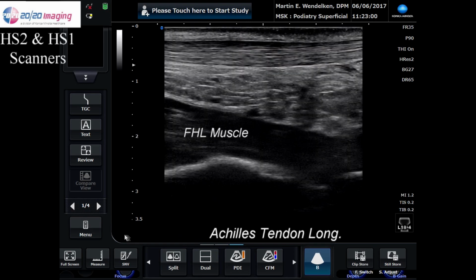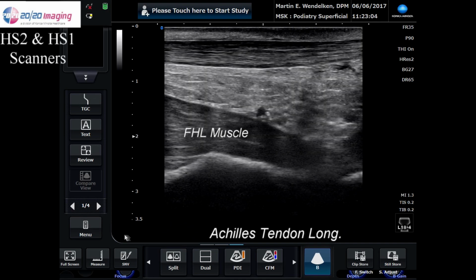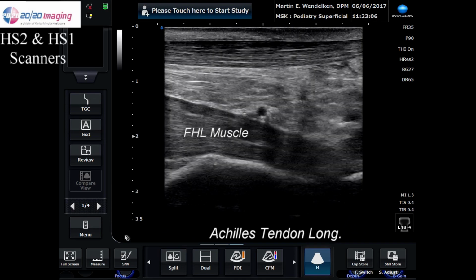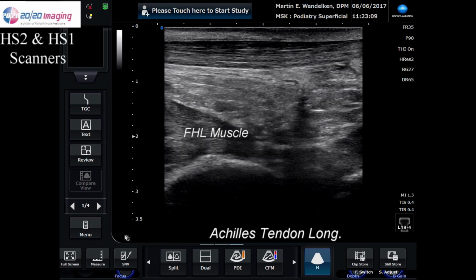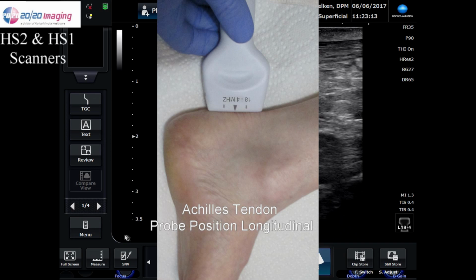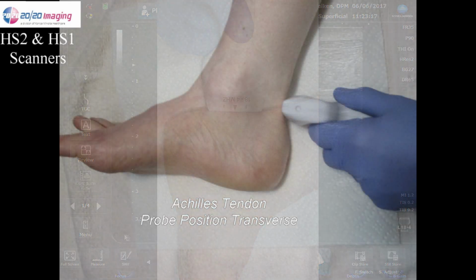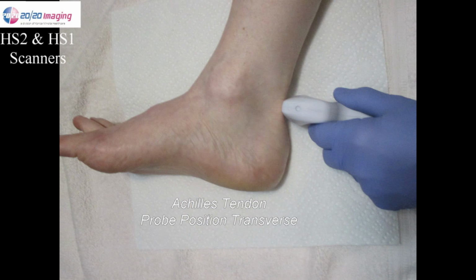Again, going now in the long axis again, I just want to show you that you can look deep down into the posterior aspect of the Achilles tendon down to the flexor hallucis longus muscle and actively see it move. This is basically the position of the probe in the long axis, and here we are in the transverse axis.